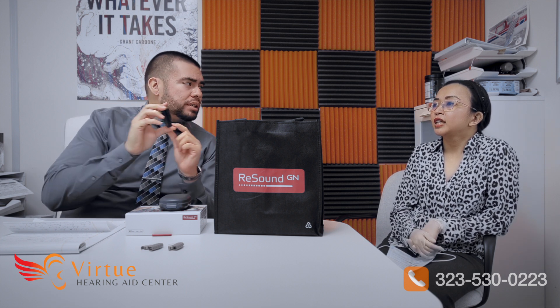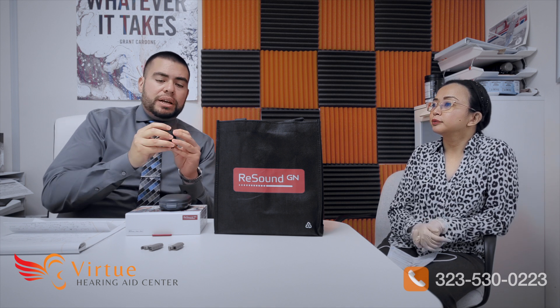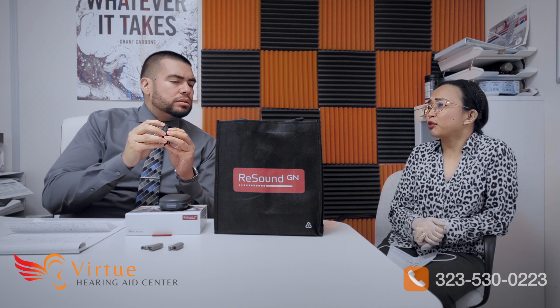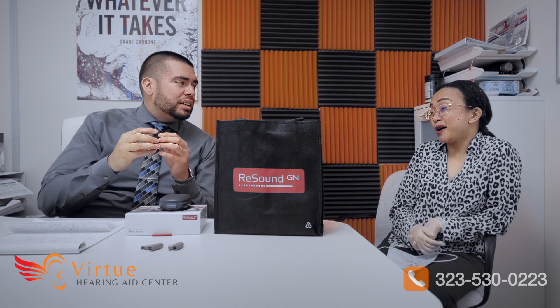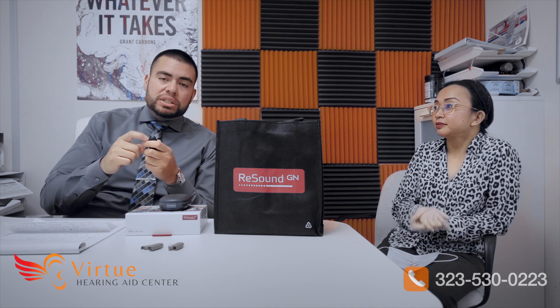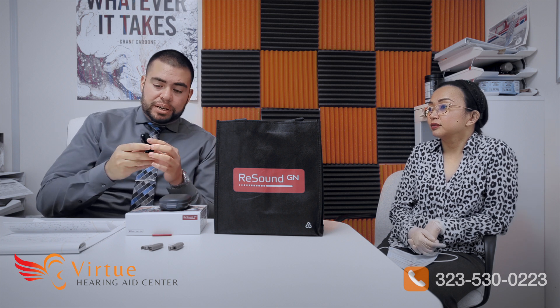It also has a 3.5mm AUX jack at the bottom. So if you have an older MP3 player, iPod, or a laptop, you can connect that cable to stream audio directly to your hearing aids. There's also a symbol for FM systems — for example, if your child goes to school and they offer an FM system, they can connect to this and stream audio to the hearing aids.